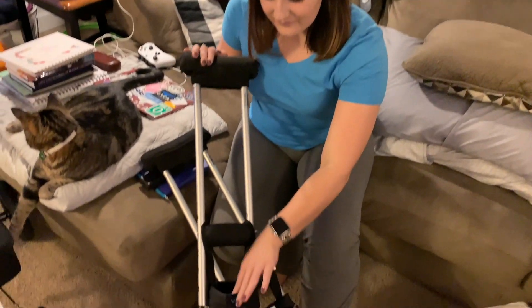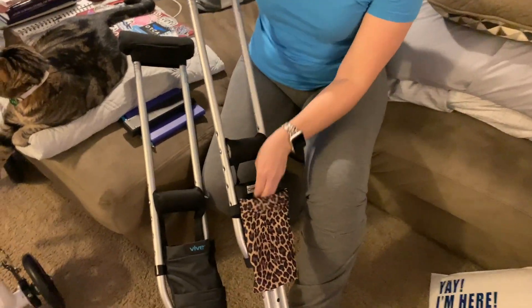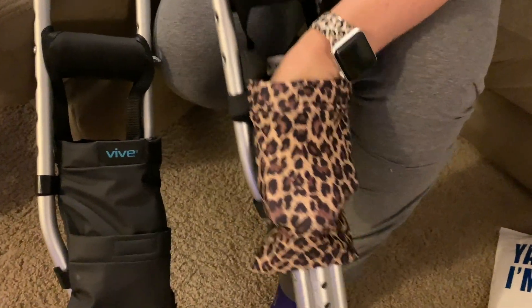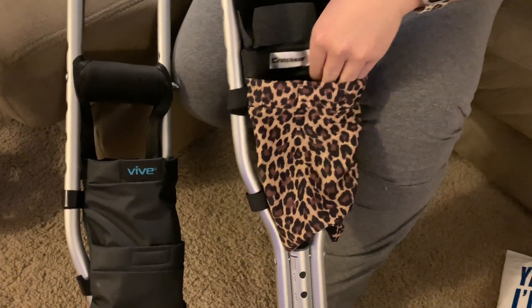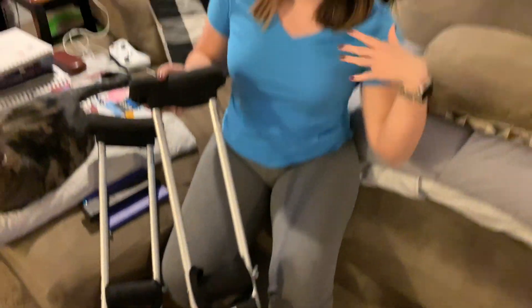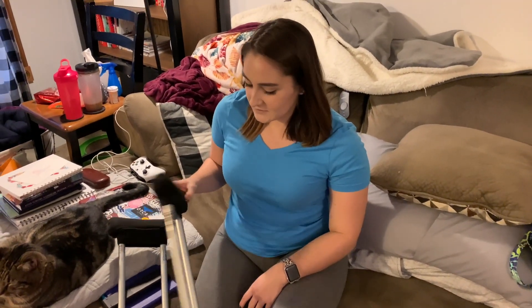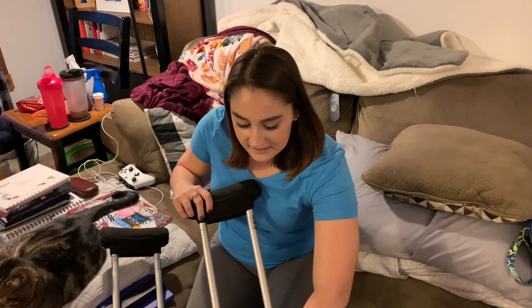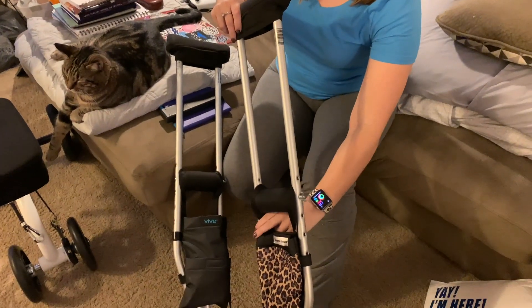I can fit bigger things in here like my wallet for doctor's appointments. This guy I just got the other day — it's by Crutcheze and it has a lot of stretch to it so I can fit my bigger water bottles and other random things I need to get up or down the stairs. All the Vive things are washable which is really nice because being on crutches is pretty much a workout and I'm sweating constantly.